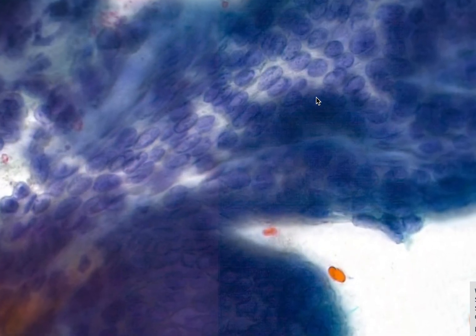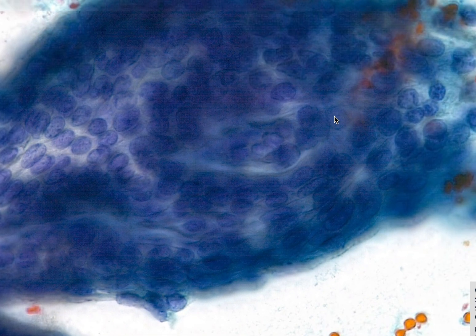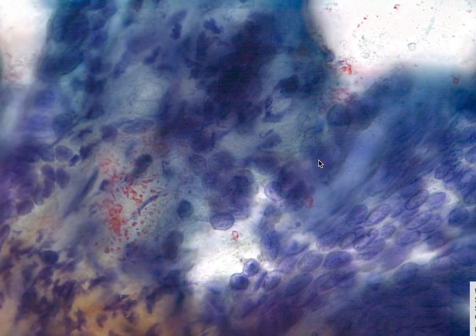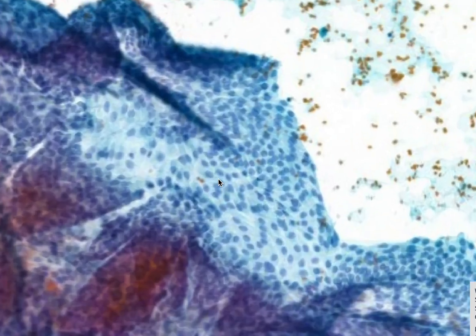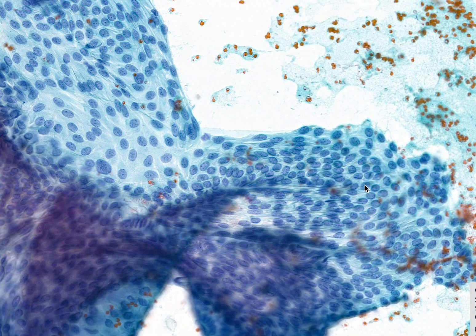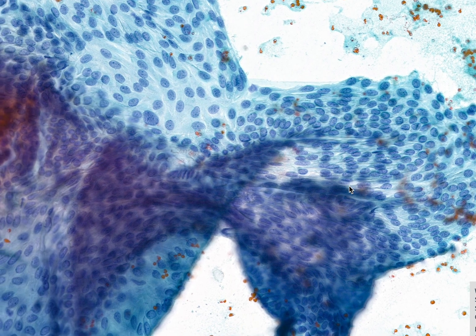This is not a centrifuge sample — it's a normal smear. You can see the papillary architecture here. If you zoom in, you might be lucky enough to see intranuclear inclusions as well. Let's zoom in here — this is your endothelium. You can see the fibrovascular core surrounded by all these cells; that's how a papillary cluster looks like, with an elongated endothelial cell and the vascular fragment. We know it's a papillary cluster, and if you zoom out you might appreciate intranuclear inclusions.